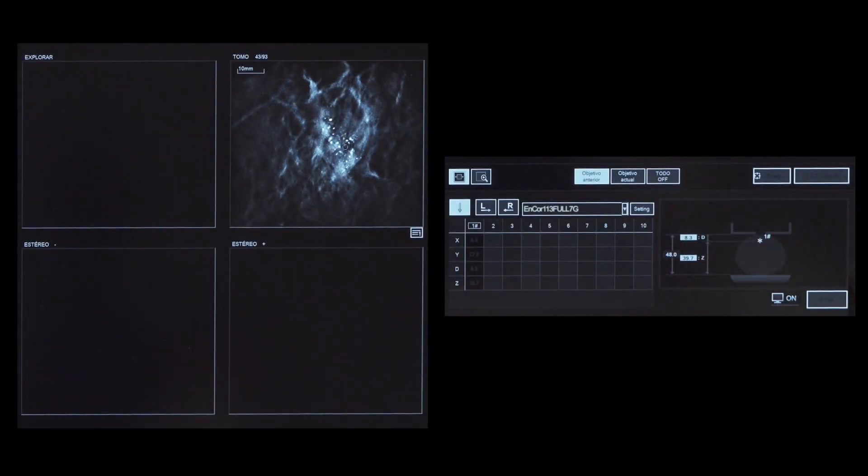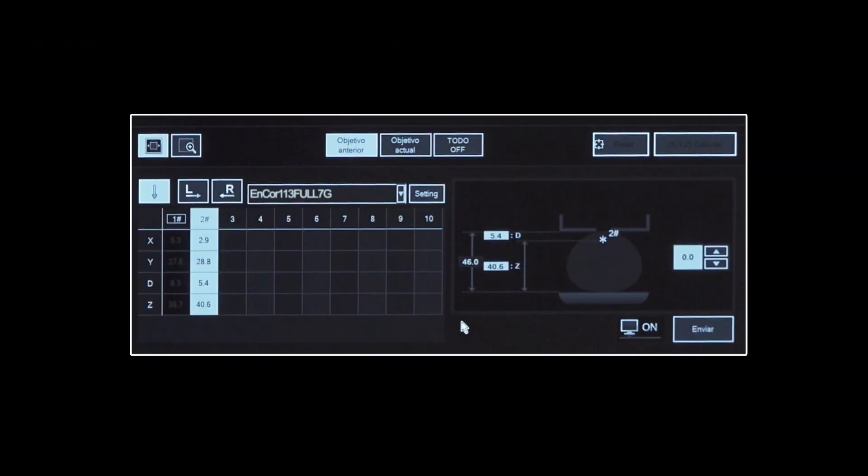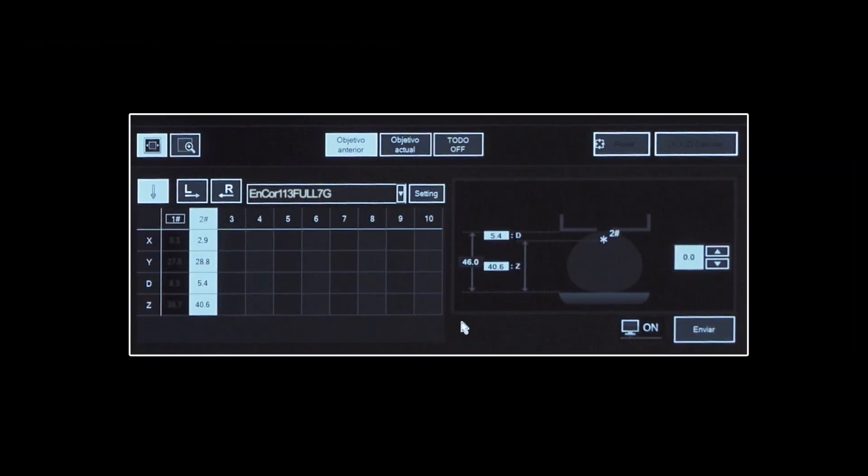Scroll through the TOMO images. Since the lesion has shifted in relation to the initial target, a new target is added. Select the target. Confirm vertical approach. Observe the new breast pictogram indications.